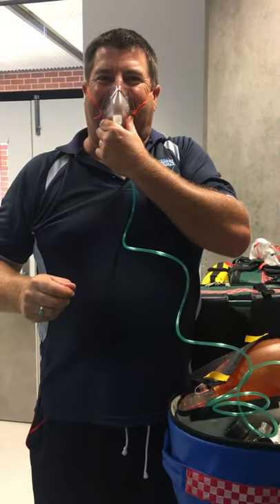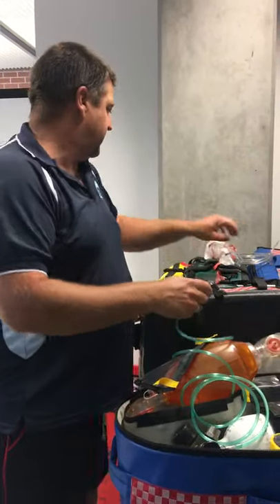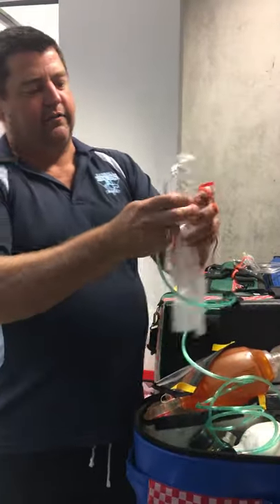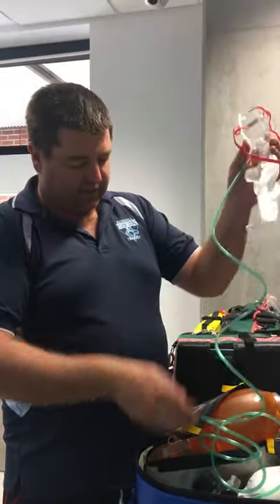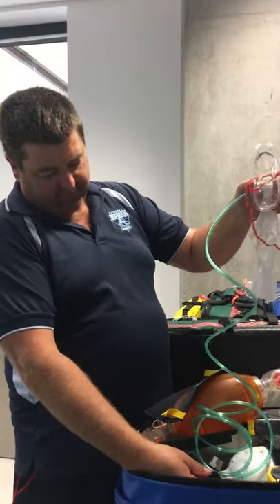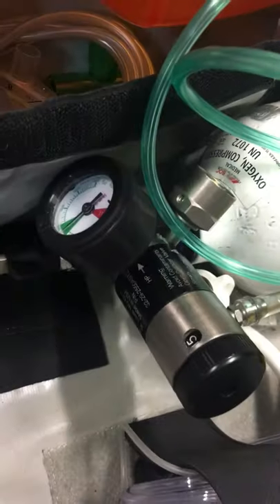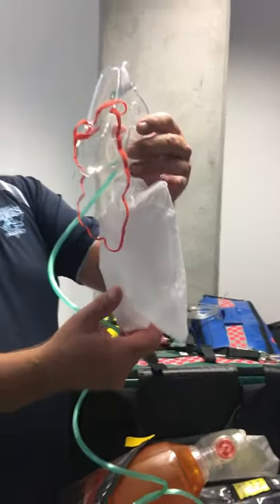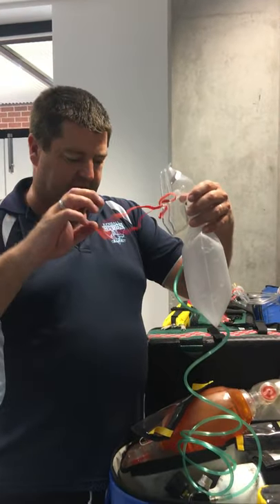This is a face mask with a reservoir bag, or a non-rebreather mask. That gets turned on at 15 liters per minute — 15 on the dial. You can see the bag needs to be full, and that will give you between 65 to 100% oxygen.